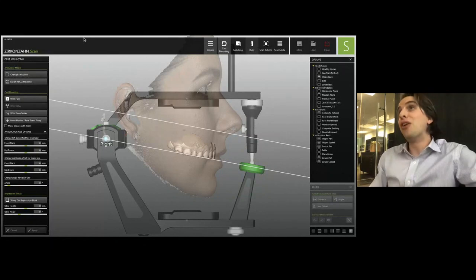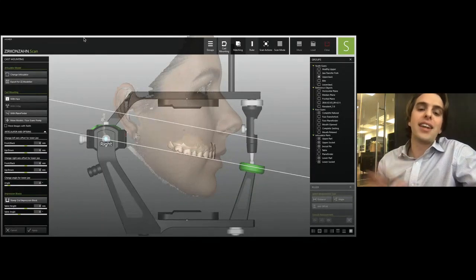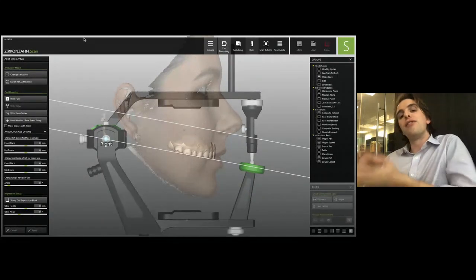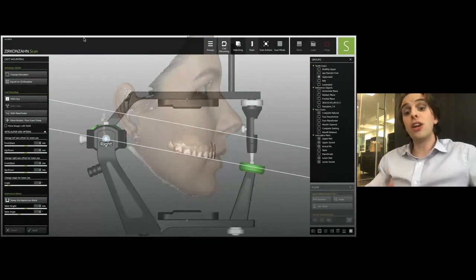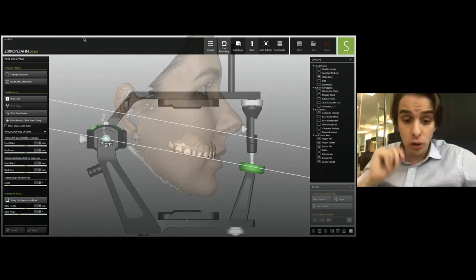And I also think it's a novelty from the historical perspective of CAD/CAM dentistry, where maybe 5-6 years ago, if I wanted models mounted on a virtual articulator, I needed to physically mount them in the articulator and scan the entire articulator mount itself. And here we did everything in reverse. We took strictly digital information and we brought these elements onto a virtual articulator.